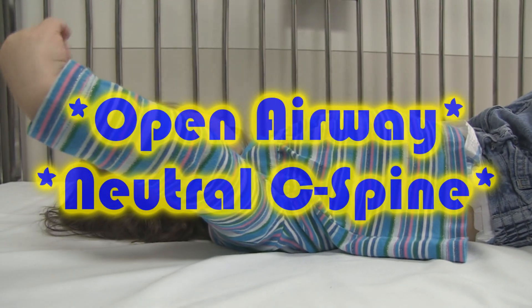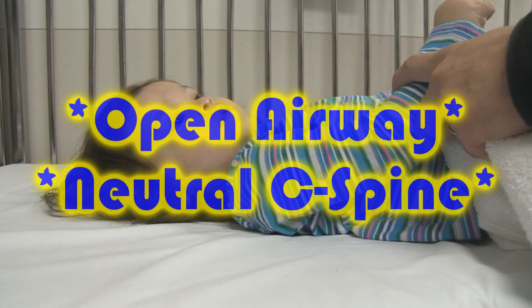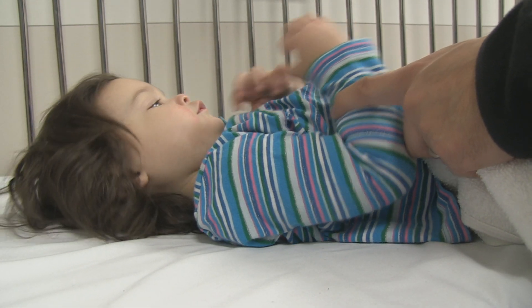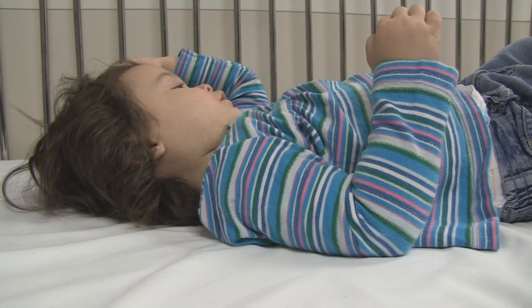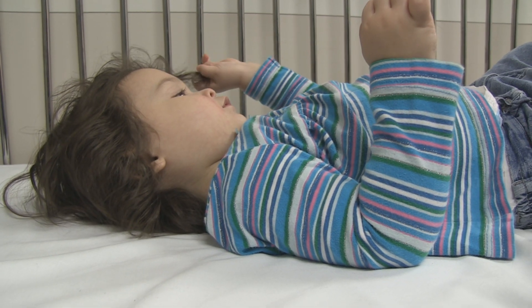What we're going to do today is demonstrate the benefits of putting a towel underneath the shoulder. When children are laying flat on a backboard, or if you're getting ready to intubate, the alignment is not perfect. Putting padding under the shoulders will give you more of a neutral C-spine and get rid of that anterior flexion you see because of the large head.